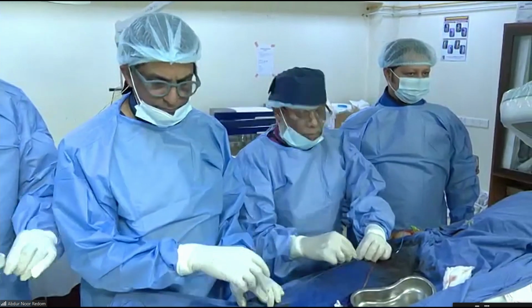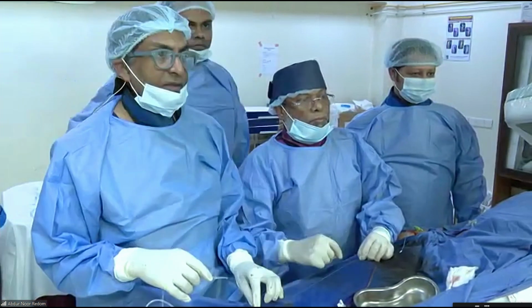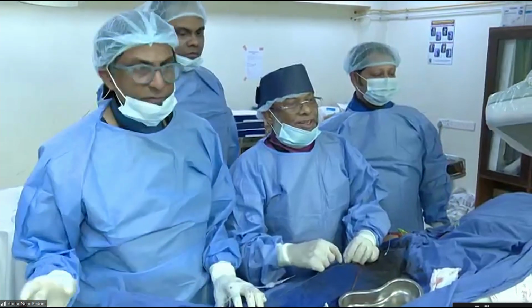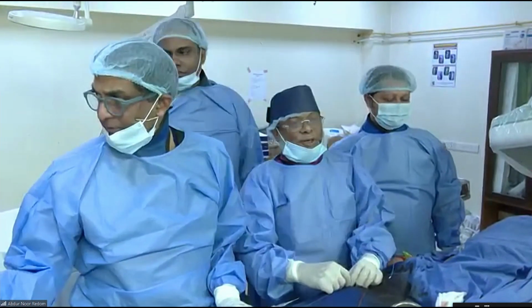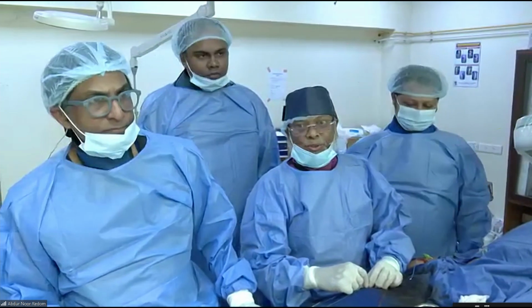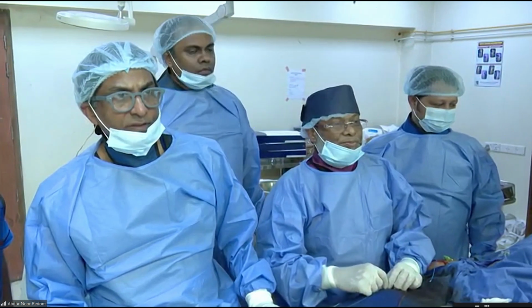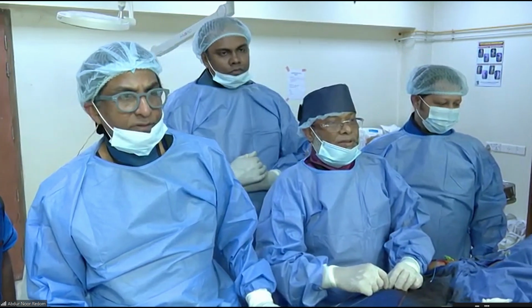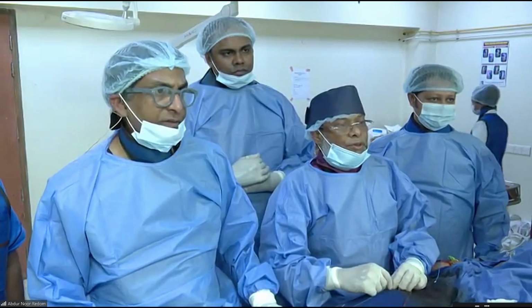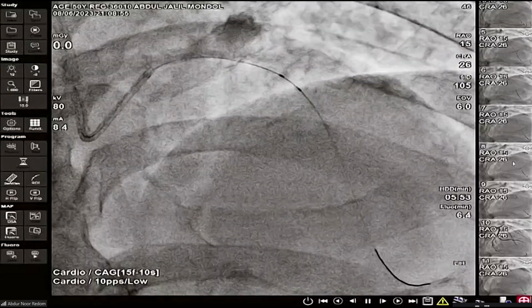So, sir, what is your strategy to predilate? Is it 0.75:1 or 1:1 in such a calcified lesion? Preferably 1:1, but initially we have taken a bit lower, a 2.5 balloon, and the vessel diameter is 2.75. So you are telling it is a fibrotic lesion. Do you consider a Wolverine balloon for adequate preparation? We see first the result with the NC balloon.